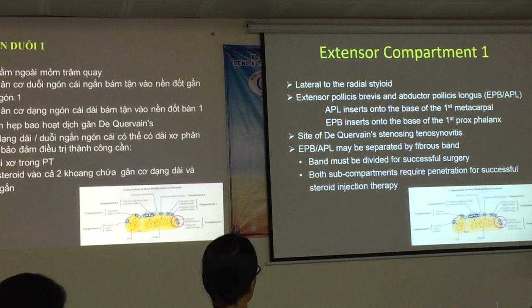So when we do injections into this, it's very important to make sure that we put the steroid around both of the sheaths of these tendons.